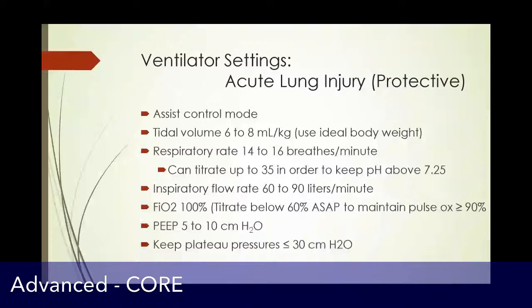And the respiratory rate, something lower initially, but you can go up to meet their physiologic needs, even up to 35 respirations a minute, if that's what their physiology demands.